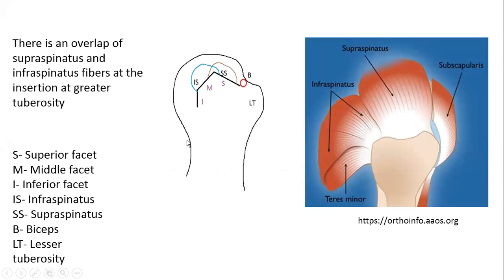Before I start, because everyone is doing shoulder a lot more than any other body region, I'm going to talk a little bit about the shoulder area, because some people are having some difficulty scanning supraspinatus and infraspinatus. I just wanted to reiterate some points, and I have been using these slides in the past as a webinar and also during the modules.